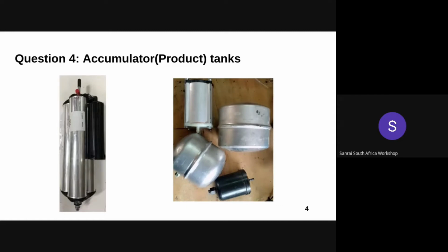Secondly, concentrators are designed in a different way to accommodate the parts that come with that concentrator model. Thus, there will not be enough space in the SF Elite concentrator to accommodate a product tank that is bigger.